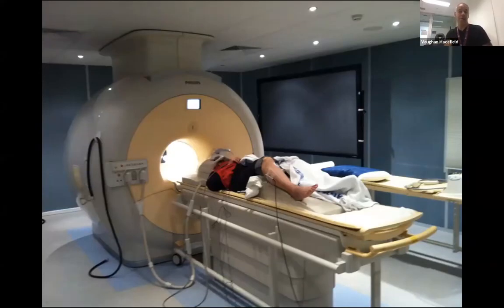We're actually also doing this at the 7T facility in Melbourne, and I developed the background for this at the 7T facility in Nottingham. All the physicists there measured the temperature of the electrodes in the scanner when they were embedded in agar. They were satisfied that there wasn't going to be any heating. And then we made the first recordings at 7T in Nottingham.